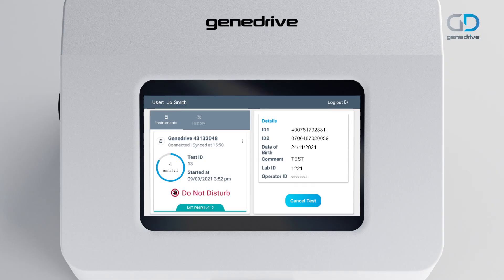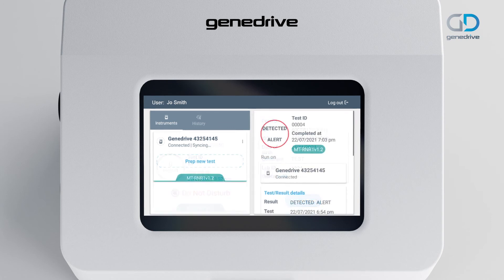The test results will be displayed on the GeneDrive system screen. A detected result indicates that an MT-RNR1 variant has been detected and the patient is positive for the allele. A not detected result indicates that an MT-RNR1 variant has not been detected and the patient is negative for the allele. Test failed indicates that various quality metrics have not been met and the test has failed.